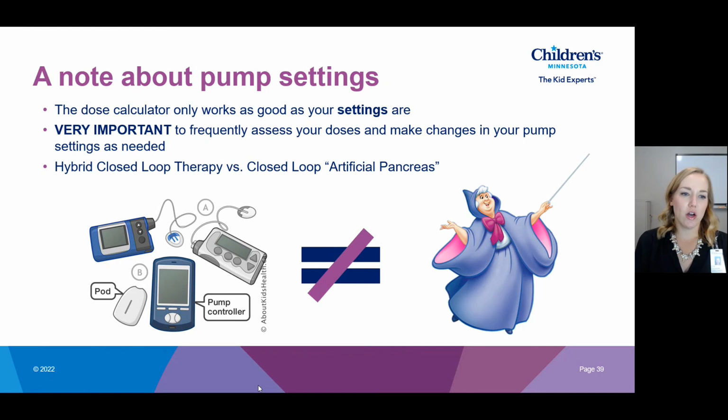Now, I do want to touch on hybrid closed loop therapy versus closed loop artificial pancreas. A lot of the pumps on the market nowadays do offer hybrid closed loop therapy. I'm going to get into that a bit on the next page. And you will see in marketing that they're listed as artificial pancreases or closed loop systems. They are not artificial pancreases or closed loop systems.